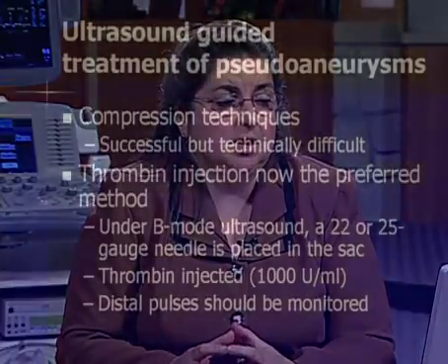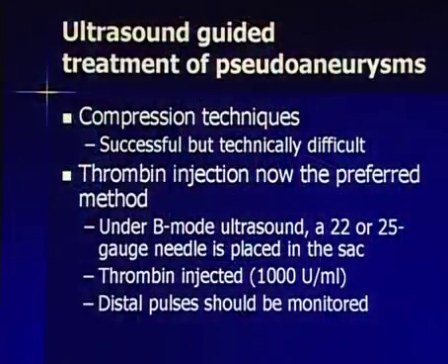Now, ultrasound has gone beyond just a diagnostic modality, and we actually use it as a treatment modality as well, in that ultrasound guidance is performed during the treatment of pseudoaneurysms. Years ago, we did these compression techniques where we basically got right over that neck or track and compressed with the head of the transducer to stop blood into the pseudoaneurysm.